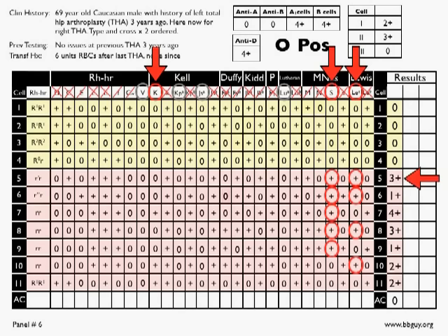Okay, yeah, maybe. Cell 7 doesn't make a lot of sense because you've got a 4+. Yeah, it's double dose for big S, but it's nothing for Lewis A. And it's actually stronger than 5, where you had a double dose Lewis A. So that one's not real logical. Cell 8 is just like cell 5. So that may or may not work.